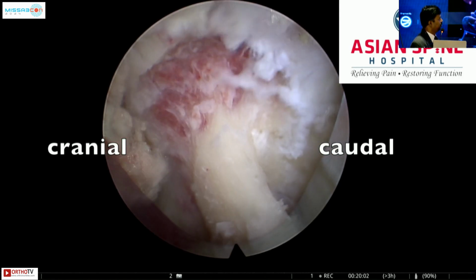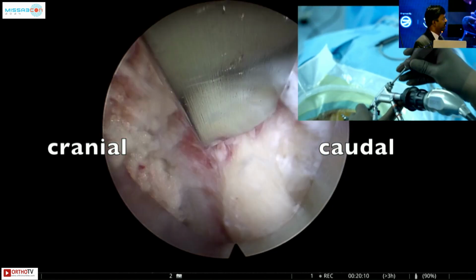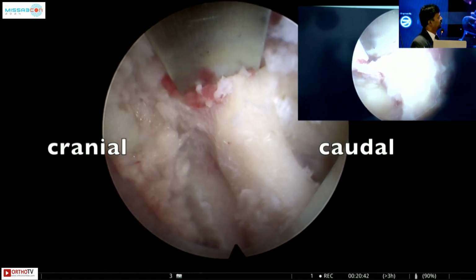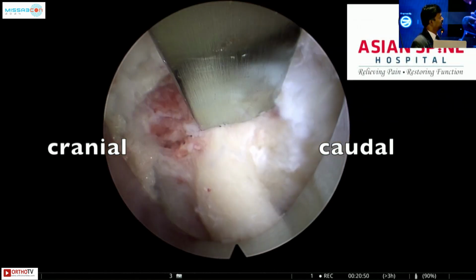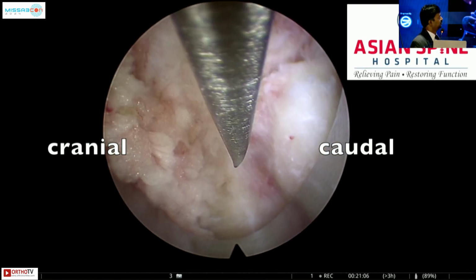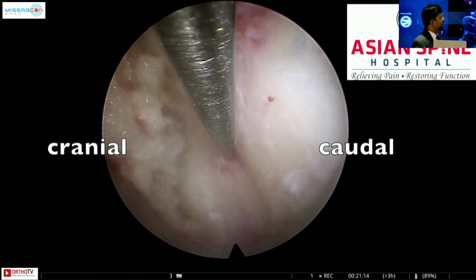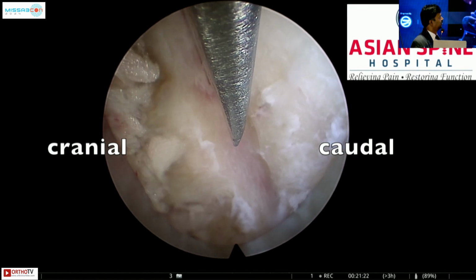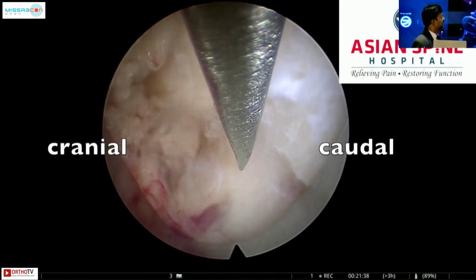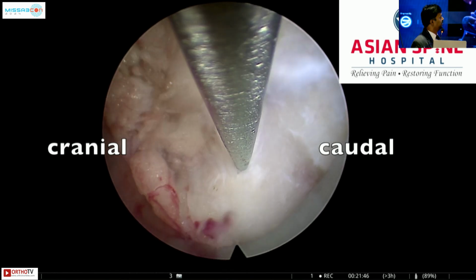The entire bone with the entire joint, the facet, comes out. I'm using my specially designed chisels. These chisels were designed by Mahesha, and they are very, very useful. I'm just using them, and my assistant is helping me.